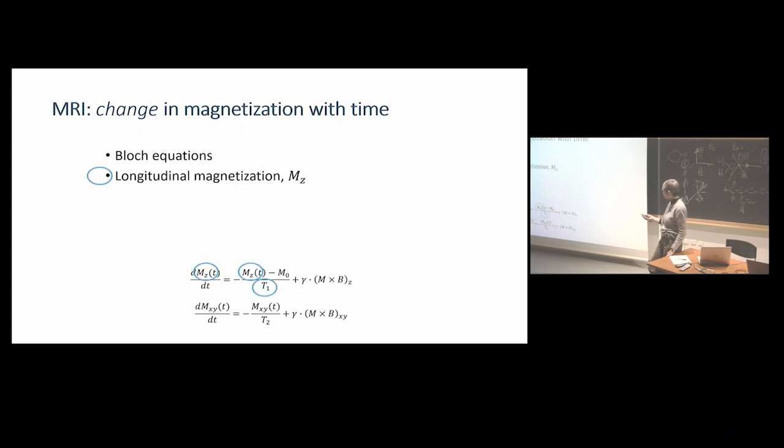Okay, so how does it work? We have the longitudinal magnetization, and when we shorten the repetition time, we get a suppression of the signal. When we do an inversion recovery sequence, we get more and more signal with time. So we can indirectly measure the relaxation time, although we cannot observe this directly.